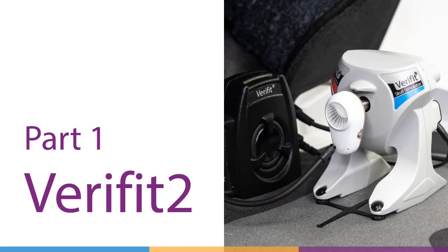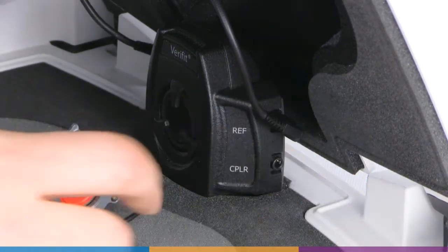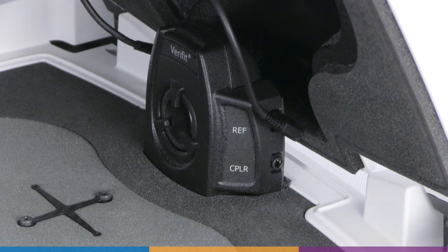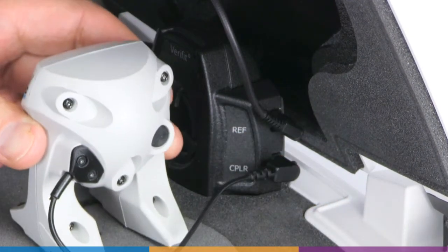Part 1: Using the Skull Simulator with the Verifit 2. First, disconnect and remove the coupler microphone from the Verifit 2 test box. Remove the Skull Simulator from its packaging and connect it to the coupler jack on the lower right-hand side of the speaker enclosure.